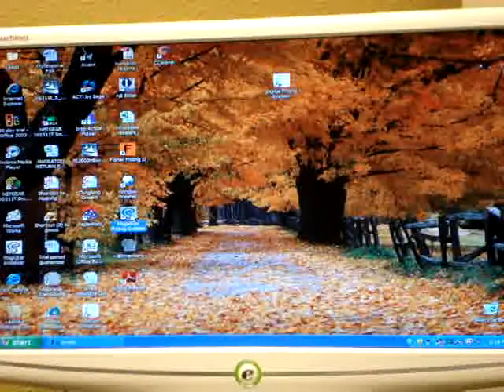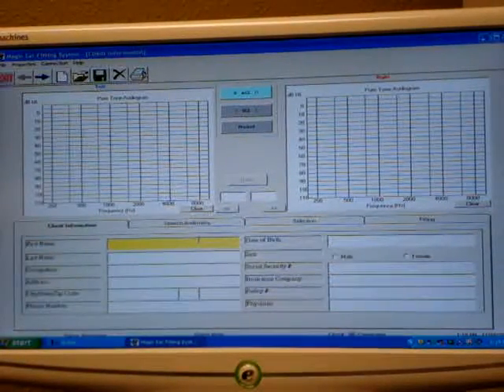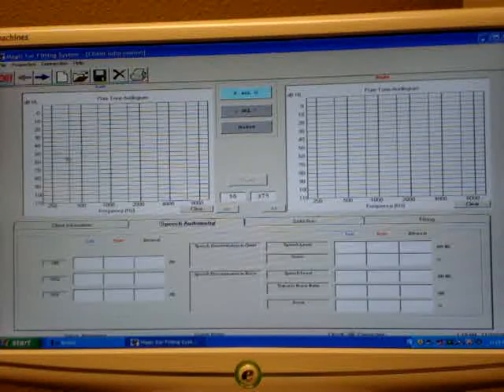Step 1, open up the Magic Ear fitting software. Enter the client's first name and then their last name. Click on the Speech Audiometry tab. Enter the client's audiogram, left and right side.